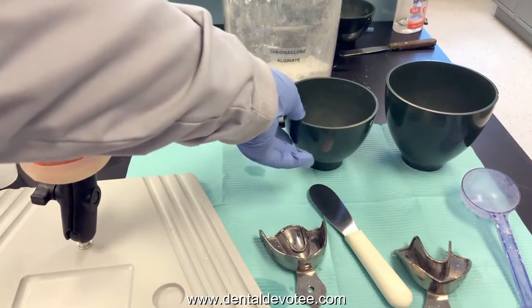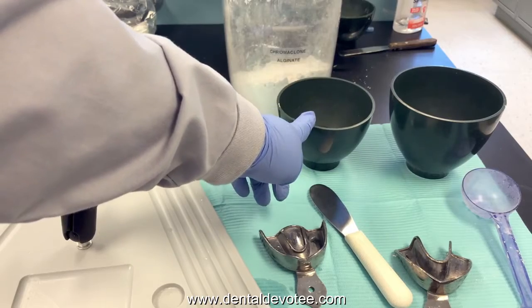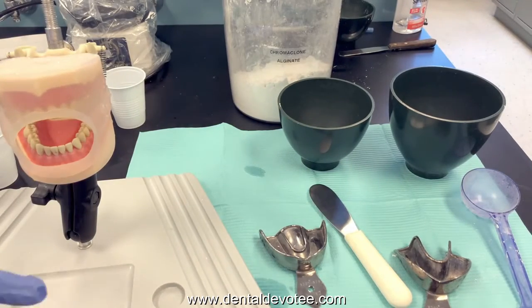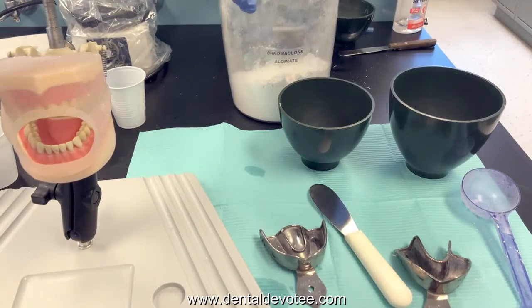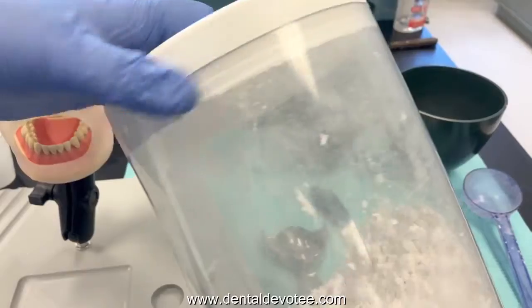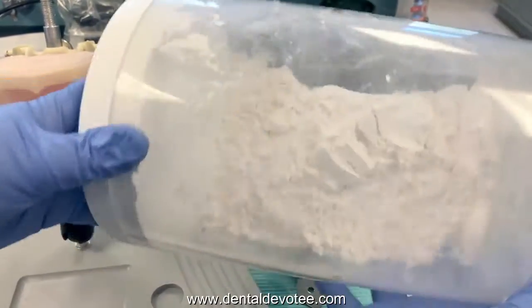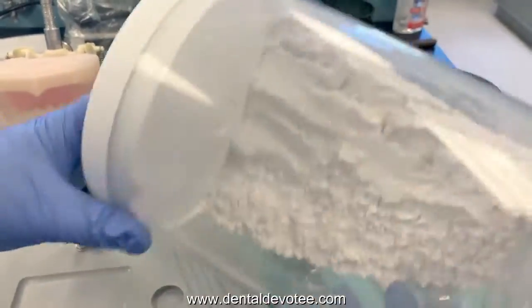Once your trays are sized properly we can do our mixing. I've already measured out my 40 milliliters of water. For Chromaclone you can go up to 45 milliliters — that will give you a looser, runnier mix, which might be helpful when first starting out. Chromaclone naturally mixes to a thicker consistency for patient comfort so it doesn't run to the back of their throat. So starting out you could go up to 45, but 40 is the right measurement.